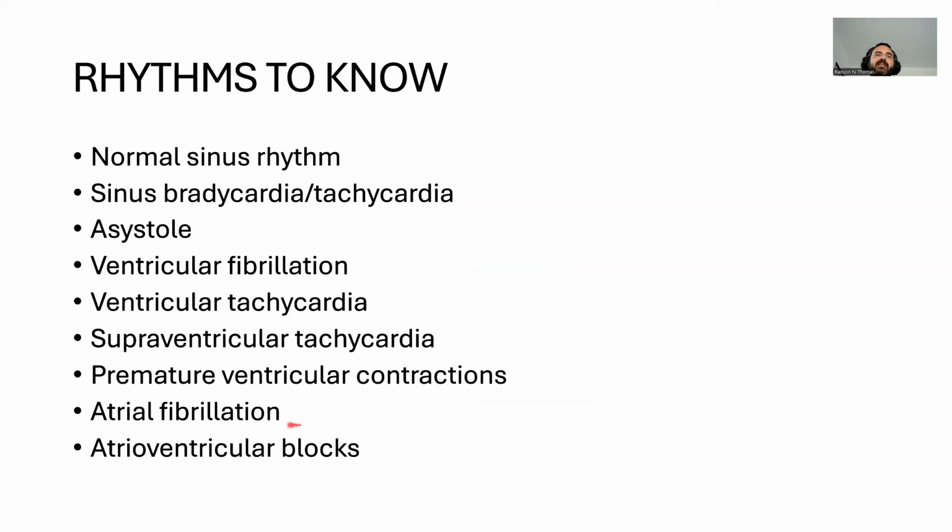So for example, when we get to these atrioventricular blocks, what we call AV blocks, there are different types of AV blocks, and they manifest themselves and look differently, and they have some different treatments, and they also are different in terms of their severity, right? How bad they can be for the patient, what kind of treatment they need, et cetera. We're going to be focused on mostly just, hey, what are they? How do we know what they are when we see them? And yeah, how do we treat them?